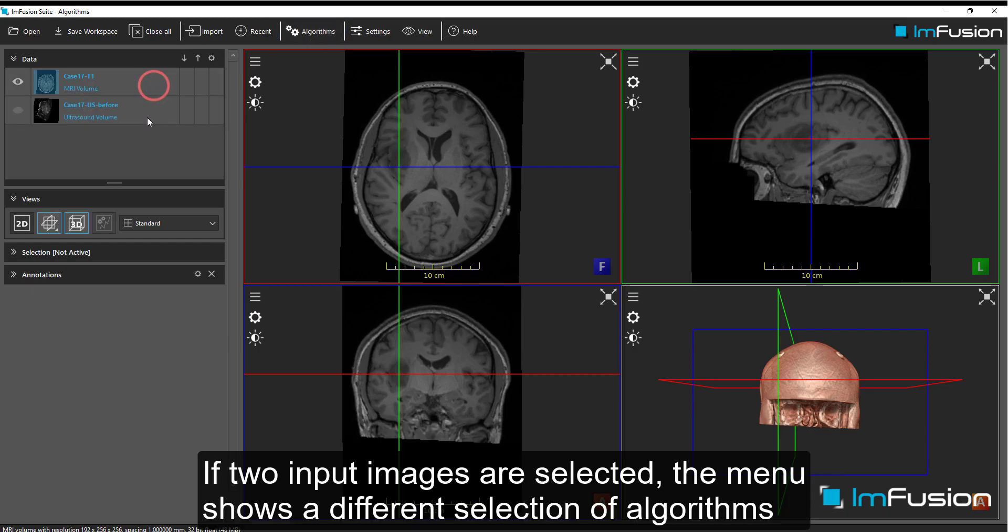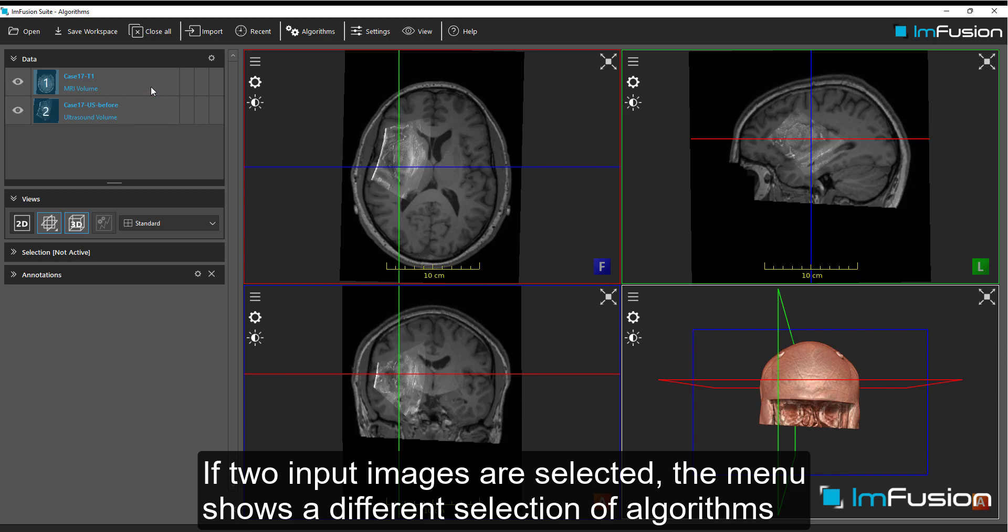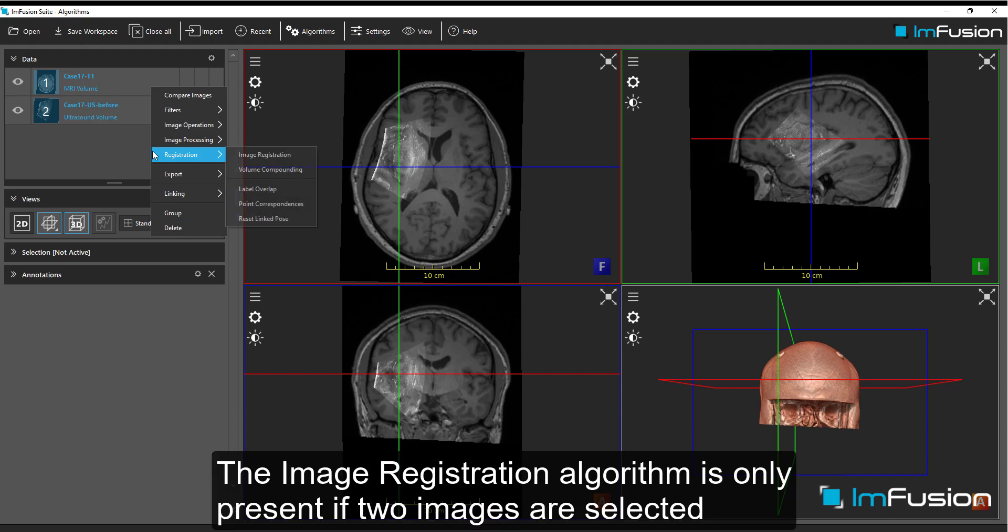If two input images are selected, the menu shows a different selection of algorithms. The image registration algorithm is only present if two images are selected.